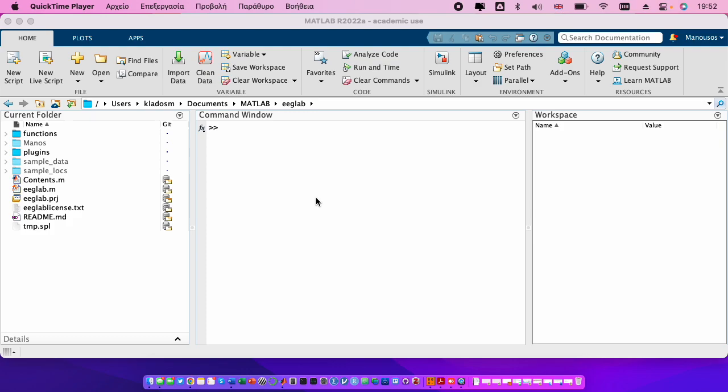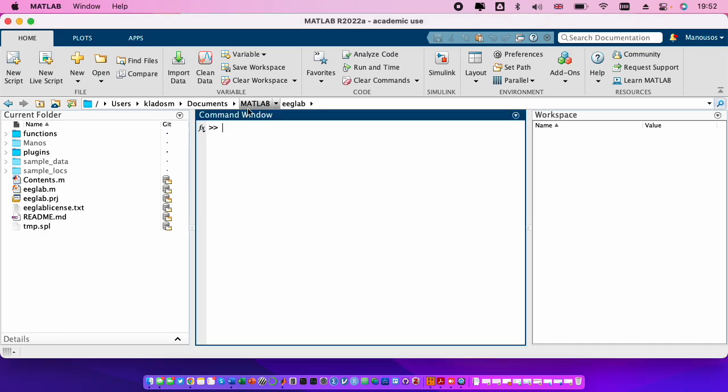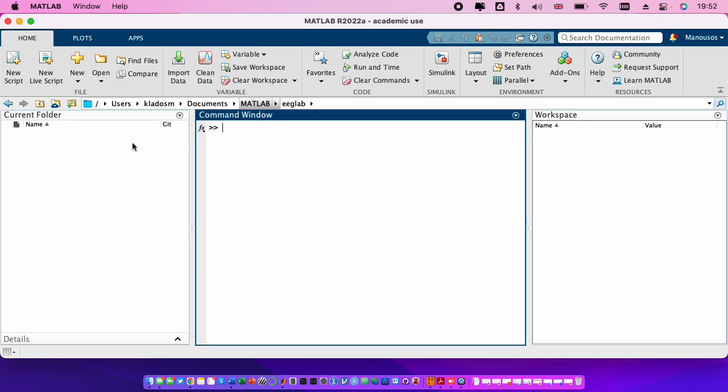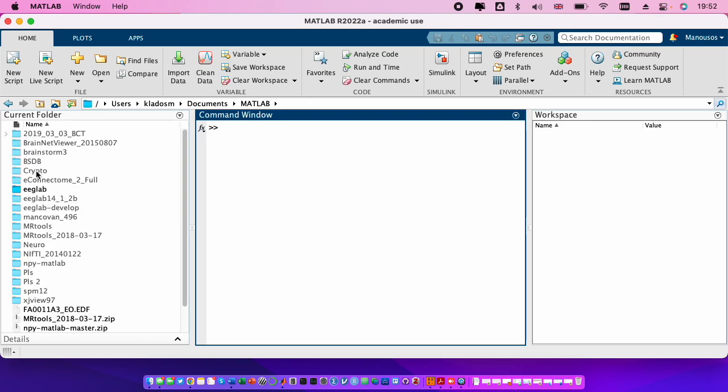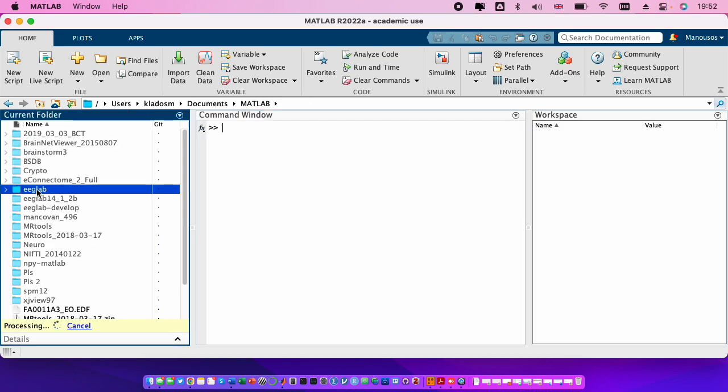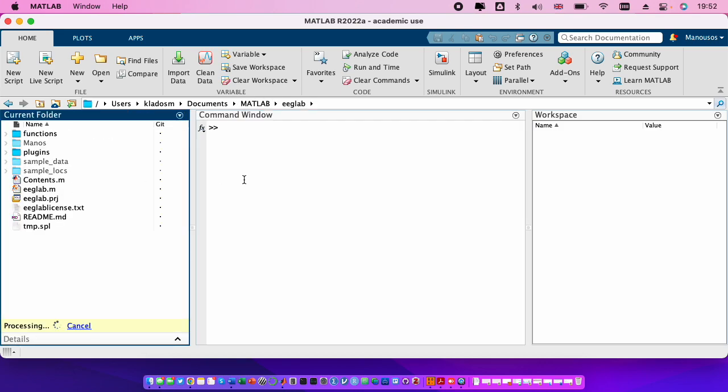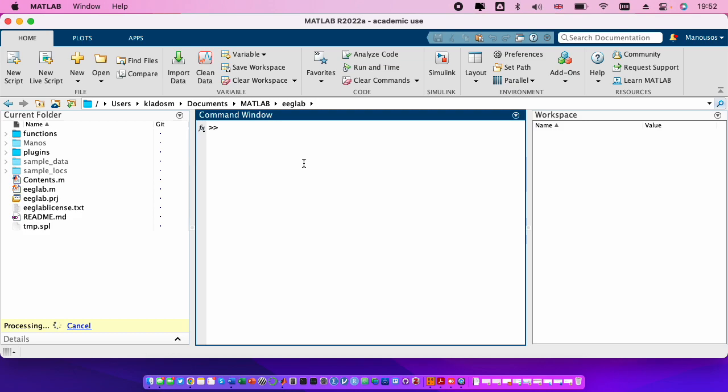Welcome to the EEG preprocessing tutorial. The first step that we need to do is to open the EEGLAB. In order to do that we go to the folder that contains the EEGLAB and we just type EEGLAB.